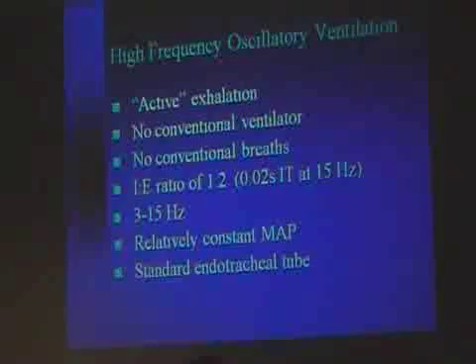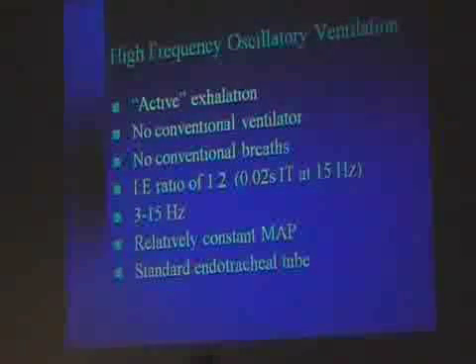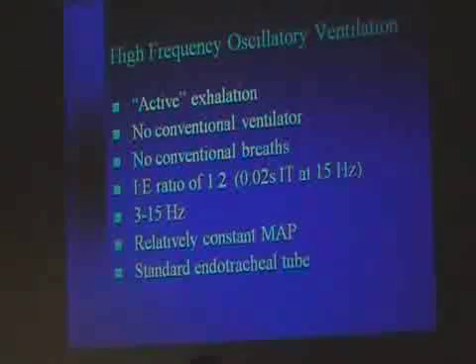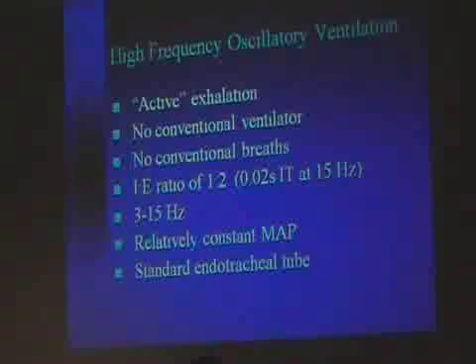All right, so I'm going to have a couple of things comparing and contrasting the jet and the oscillator, but mostly I'm going to spend today talking about the oscillator. I just want you to keep in mind some of the things about the jet, because it's a little bit different, and we'll talk about the jet next week. You have to keep in your mind some of these differences.